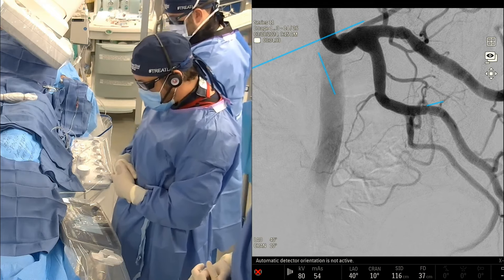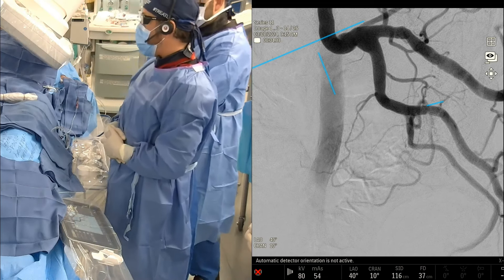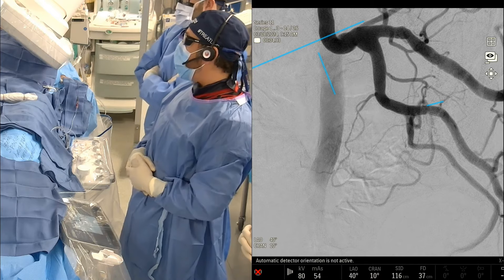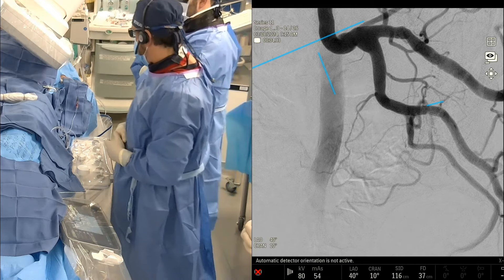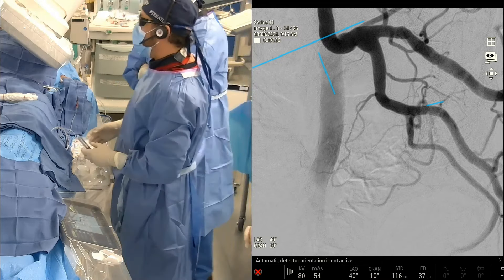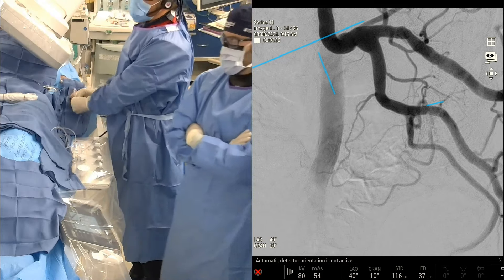Obviously, if we're using NBCA, I like to try to use balloon occlusion whenever possible — it gives us a much deeper penetration, which we can talk about in a few minutes. The other thing that we're going to try to do right now is push the base catheter a little closer to the pudendal. We could probably almost even cannulate the pudendal with the base catheter.